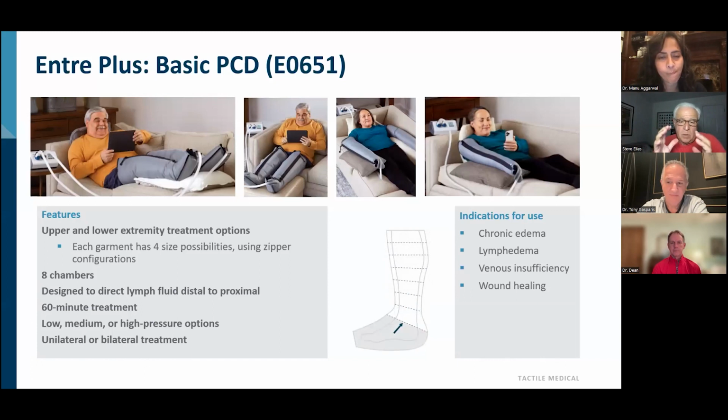So a leg is being squeezed for around 30 seconds, as opposed to the more advanced pump, which, as we said, is perhaps a little more comfortable for patients because it's not a hold and squeeze type of action. And you can see the indications here on the right side for the Entre Plus or the basic pump. All right, let's go to the next.